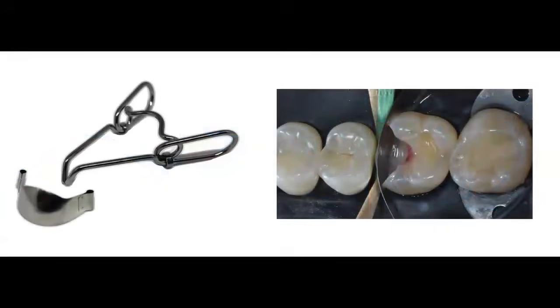Now, the other band that I also recommend for deep margin elevation is the saddle matrix band. In this particular case, I am going to elevate that deep margin that you see on the mesial box. I'm going to use this saddle matrix band, but I'm not going to use the saddle matrix retainer. So for this particular case, I was able to introduce the band, insert it, push it.